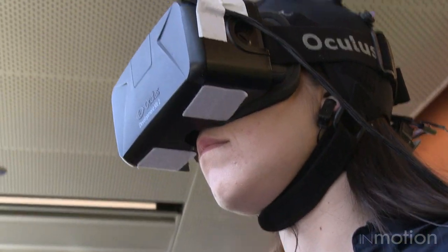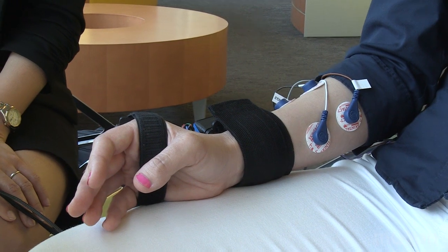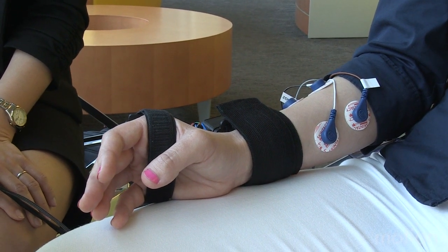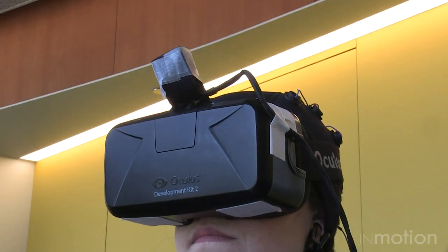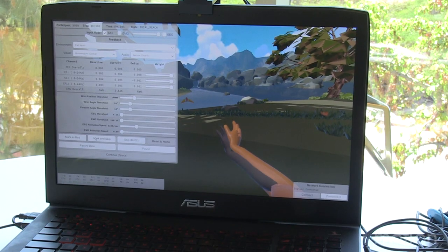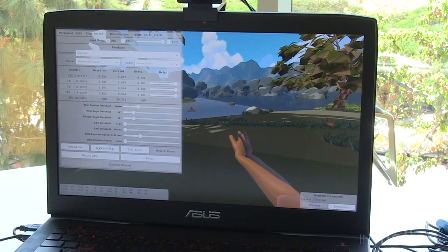So the way it works is that after a stroke, you generate a motor command to move your arm, and that command gets blocked. So people can think about moving, and we can take those signals that indicate they're thinking about moving and give them feedback in virtual reality that they're actually moving. And the feedback in virtual reality serves to reinforce those good brain signals that they had. So essentially you can think of it as brain training.